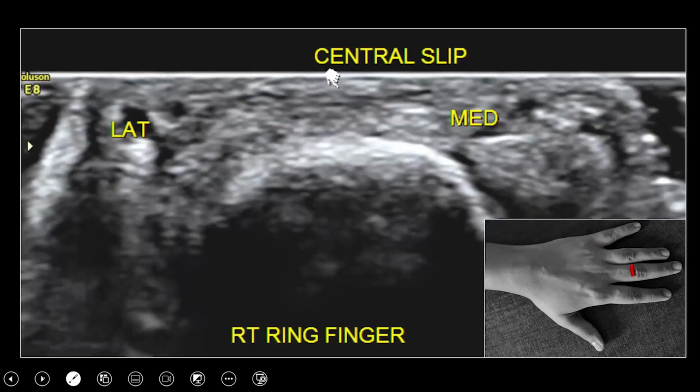If you obtain a transverse image at the level of the head of the proximal phalanx, at this level the extensor digitorum tendon is divided into three slips. So you have a central slip in the center, and on either side you have an echogenic structure. These are called the lateral slips of the extensor digitorum tendon.